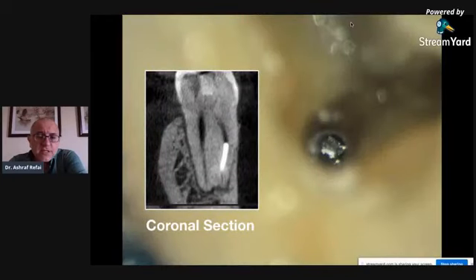And you can see this is the sagittal cross-section. That's the picture of the instrument segment inside. This is after enlargement coronally a bit, so that I could view the fractured segment. And you can see its position, and from the coronal section of the CBCT, you can also see that it's generally in a not so curved canal. The canal is curved in the buccolingual dimension, but it's quite straight in the mesiodistal dimension. But still, as you can see, I can see all the periphery of the instrument.